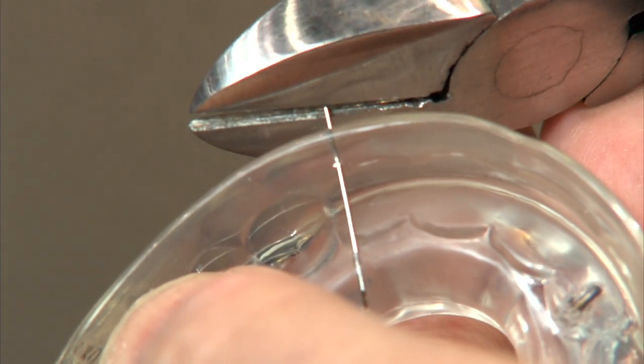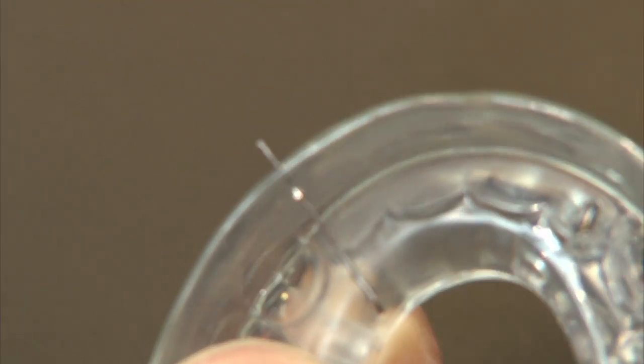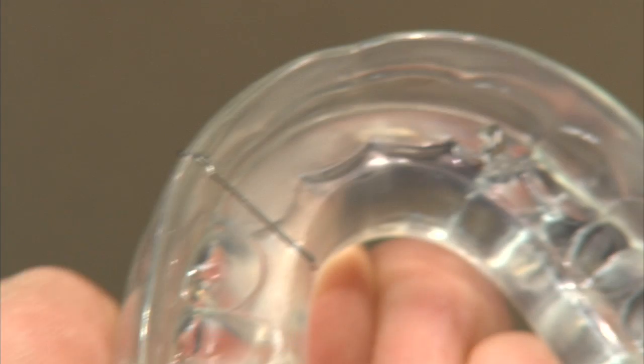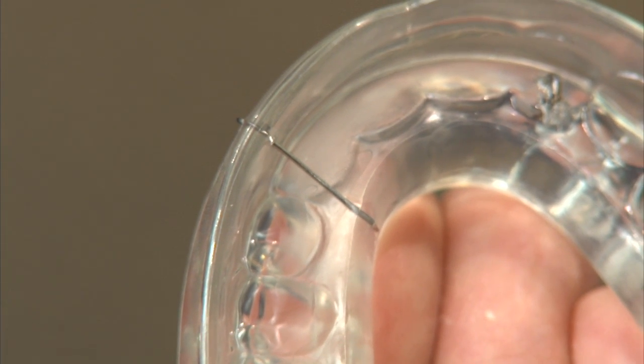We snip the end off, leaving about two or three millimeters, and then we bend this wire again. That serves to move the teeth mesially or distally.